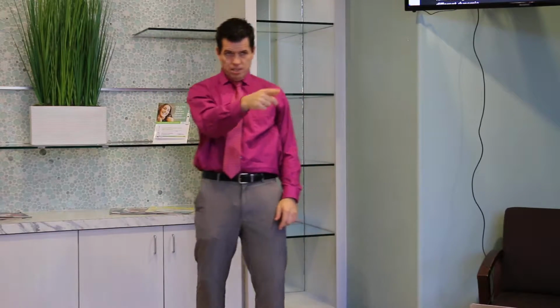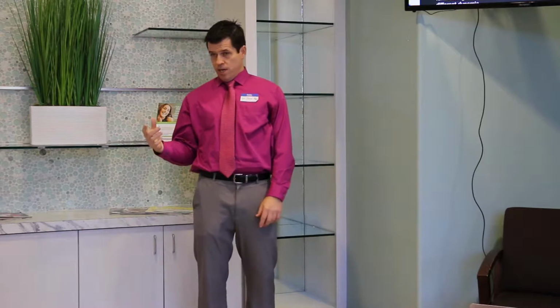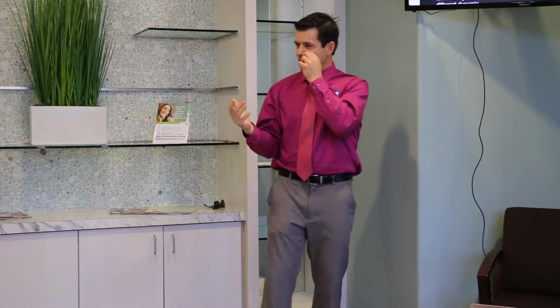Okay. Let me tell you what happens in dentistry, and this is why I don't like intraoral cameras. Somebody comes in with a toothache. I've got a big cavity in number 30. The dentist breaks out the intraoral camera, right? Assistant takes a PA. He walks in the room, says, oh yeah, let me show you this tooth, Bob. Grabs a camera, snaps a picture of number 30, puts it up on the screen this big. The dentist is thinking, sweet, I get to do my endo buildup and crown. That's my production for today, right? We're all excited when we get an emergency. We shouldn't be, right? We should feel bad for our patients, but as a dentist, you're always happy because that means you're going to be busy. So it's a tough balance.